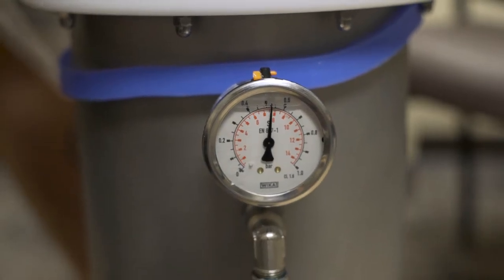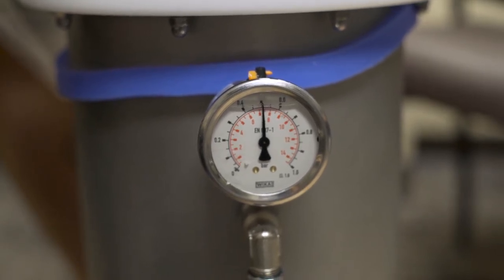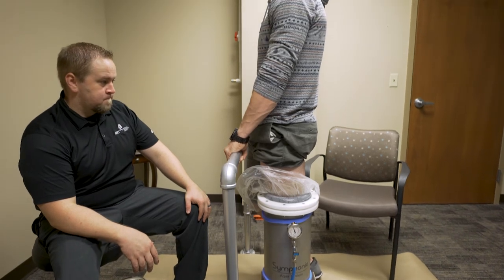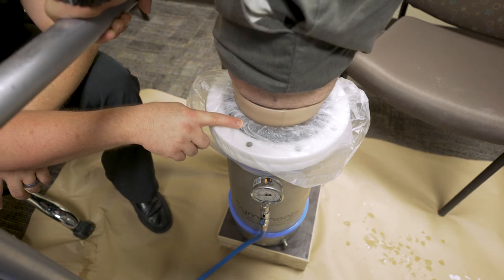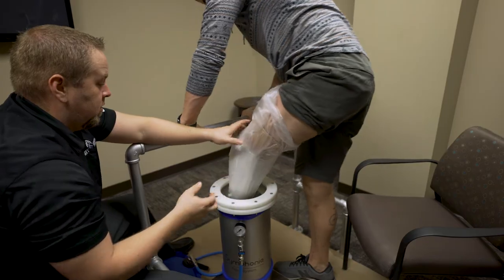During the full weight-bearing process, take note of the obtained pressure from the gauge on the front of the Symphony Aqua system, as this will become important later during modifying. After three to five minutes, or when the plaster has set off, have the patient shift weight back onto the sound side. Open the valve to allow water out of the system — the membrane will begin to pull away from the residual limb.